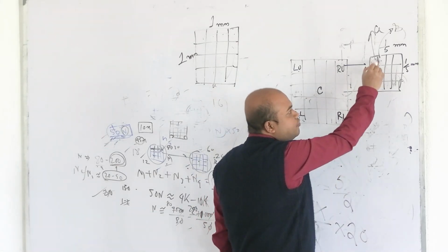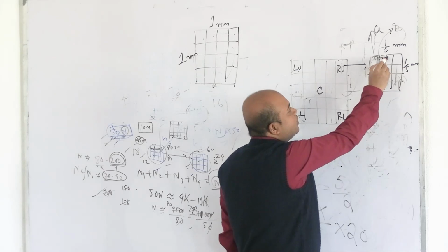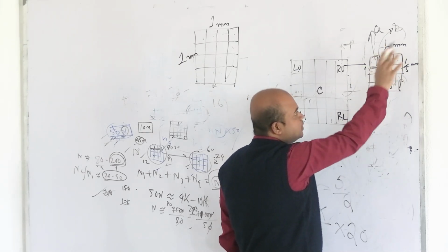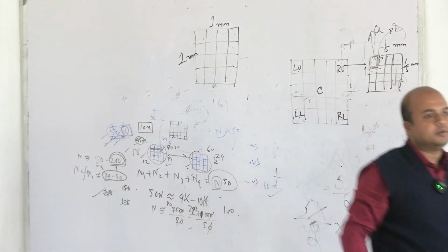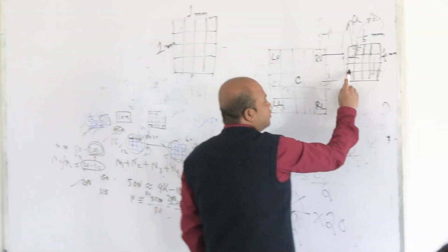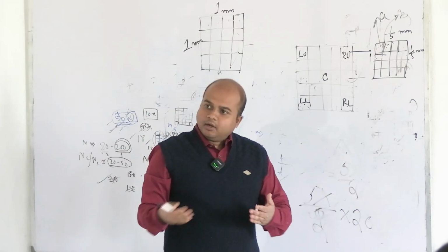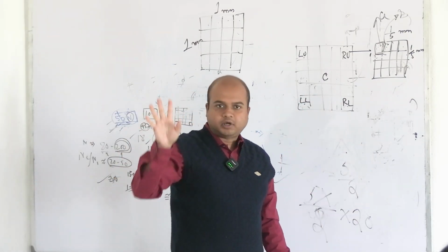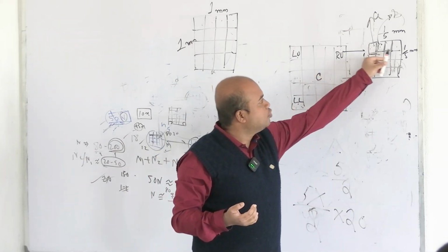Similarly, in case of B, left and lower margins are considered, obviously the central portion will be considered, this portion of the square. Similarly for all cells, A, B, C, D, or 1, 2, 3, 4, whatever. That means name them in your mind, no need to name them, so that we are counting all cells. So go from this side, you count 1, 2, 3, 4, then 5, 6, 7, 8, and this is in focus. You have to keep them in focus. The left upper square is in focus, that can be made in 40x. The whole square is in focus. So be careful, you count all the squares.